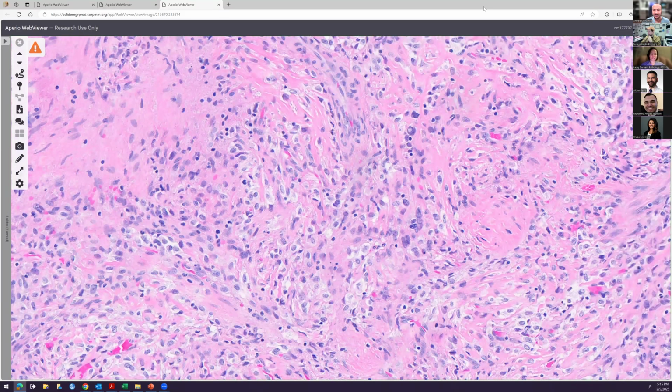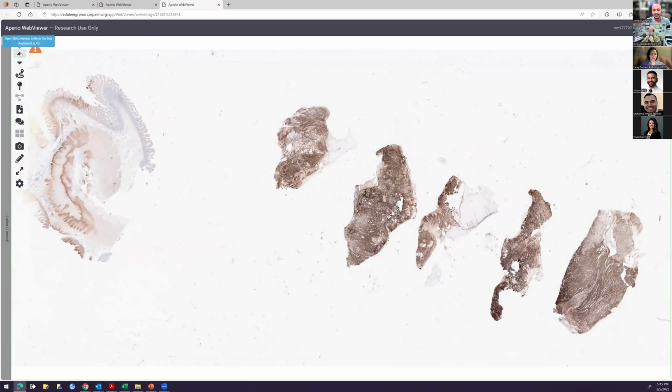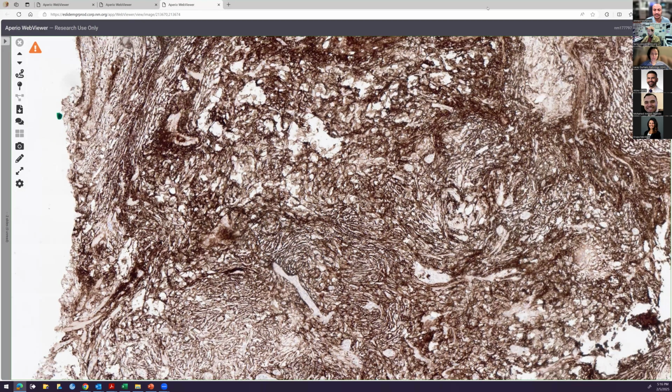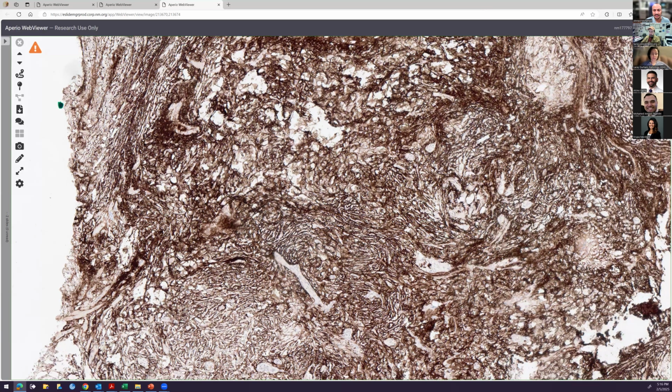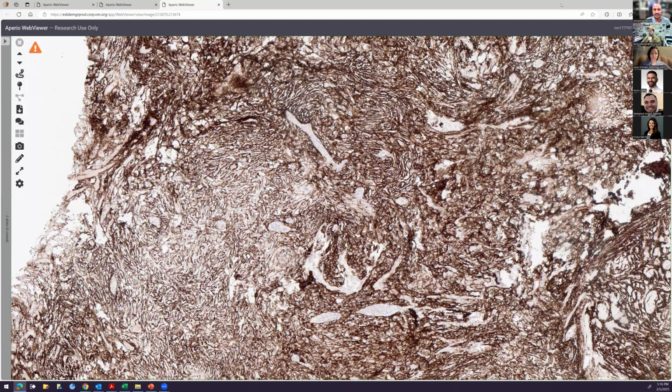So this is one of those situations, let me see, do I have a second one? I do, yeah. So this is one of those situations where we're dealing with a tumor somewhat related to the previous tumor that we were talking about. And the way they're related is through their molecular features. They're going to be the same molecular fusion. They're both MUC4 positive, and this is our MUC4 stain. Nicely MUC4 positive here. And they've actually been associated with each other. So there have been cases described that are sort of hybrids between the two of these. So I'll go ahead and show you the slide here.